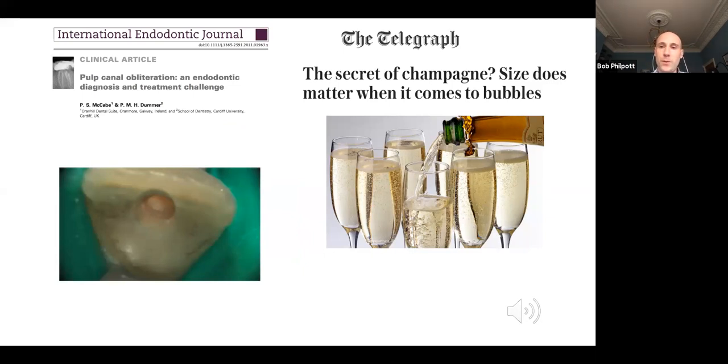But people talk about the champagne effect of when you put any type of irrigant onto a root canal orifice. So this is our same image, our same tooth we're looking at. Now it's becoming a bit more apparent, and you can see this little calcification that's there, and you're trying to chase after that, okay? So people will often talk about the champagne effect of hypochlorite. So you put it on and you get bubbling. That is only useful when you reach down to this level, okay?